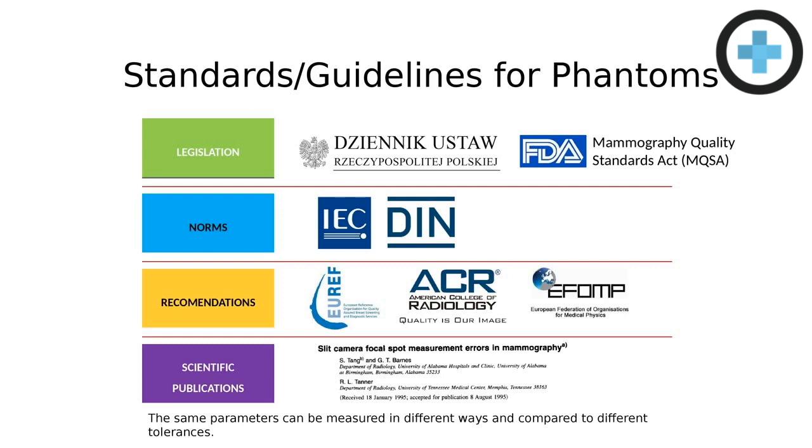Consistent image quality is crucial for the accurate diagnosis and monitoring of medical conditions. And this emphasis on quality assurance in medical imaging is critical for patient safety and the effectiveness of medical diagnostics. Without consistent standards and guidelines, it can be difficult to maintain the high level of image quality required for accurate diagnosis.